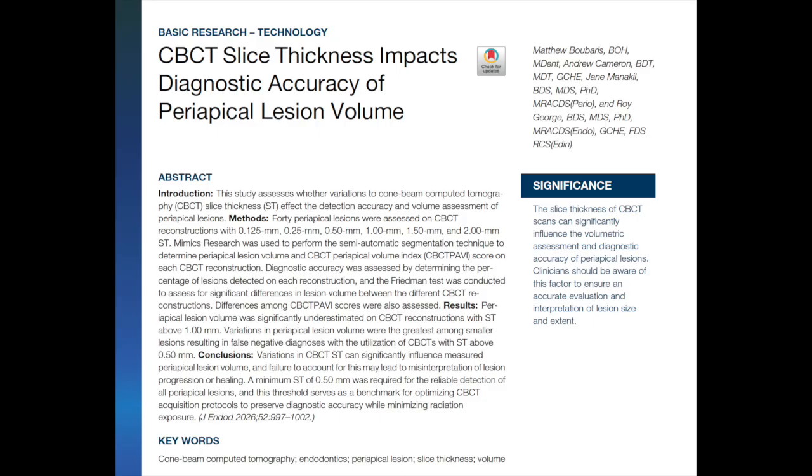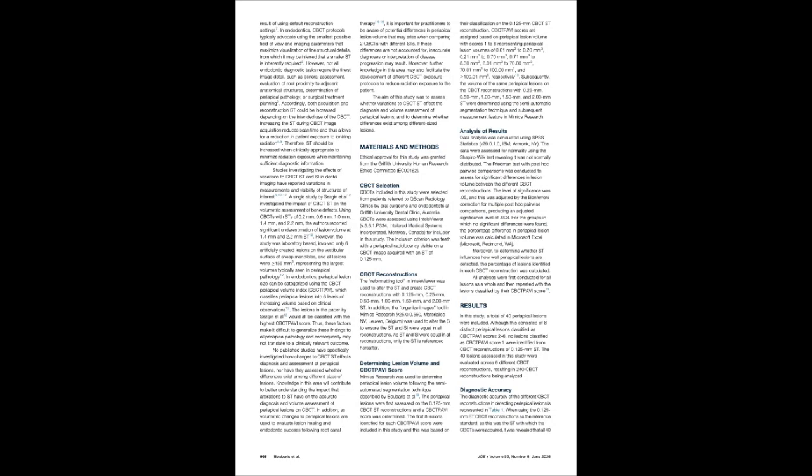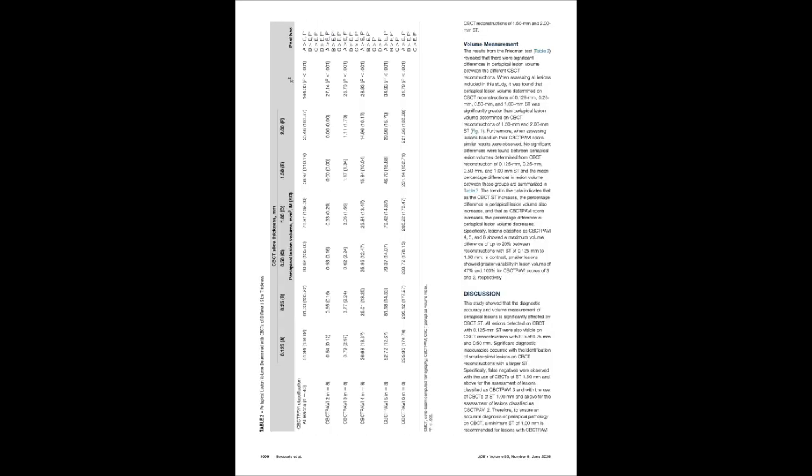In my opinion, the study utilizes the patients' real CBCT data and included different sized lesions, which enhances the clinical applicability of their findings. Although I think this approach is common in clinical imaging research, correlating the CBCT findings and adding histology to it would have provided a more definitive benchmark for the diagnostic accuracy.